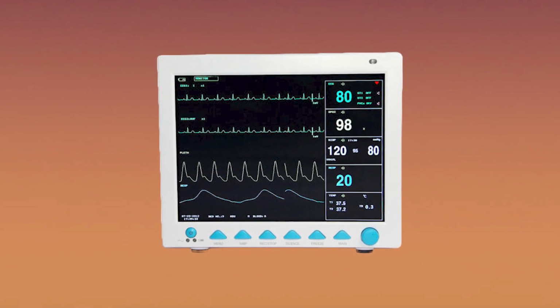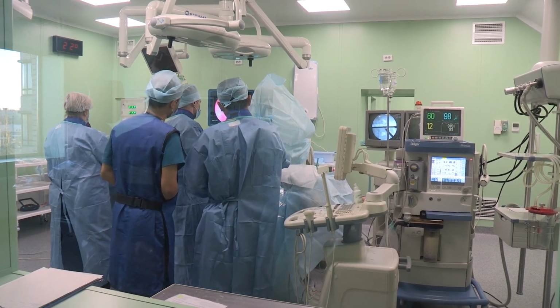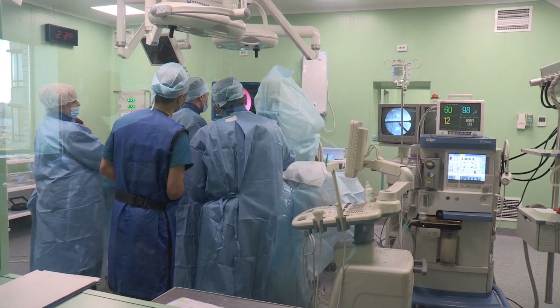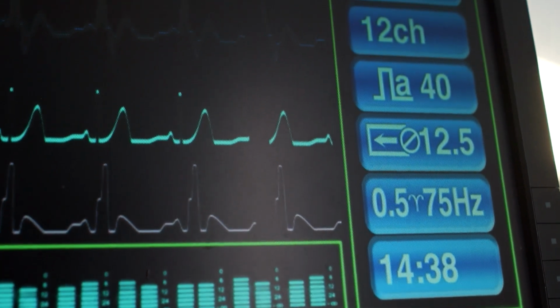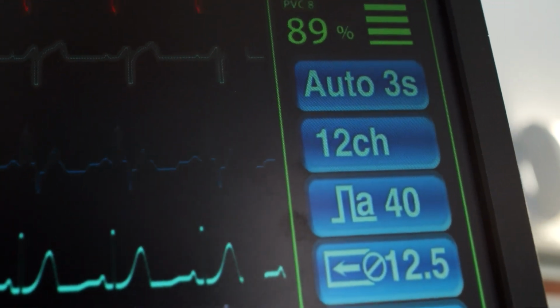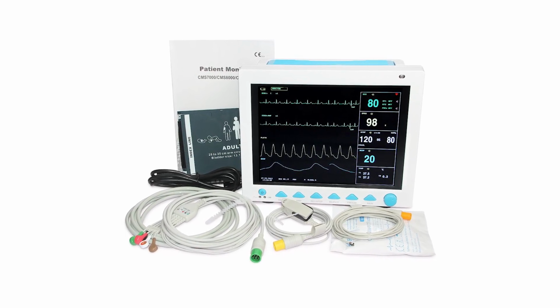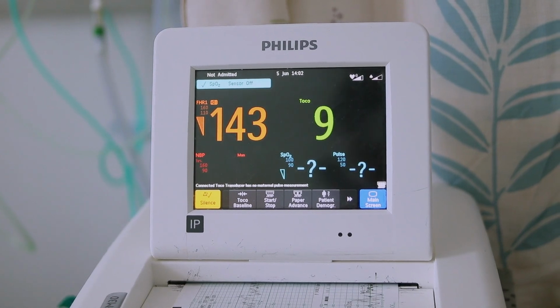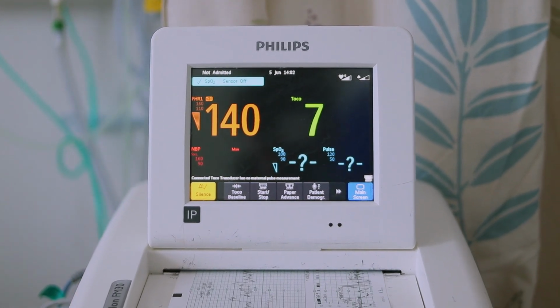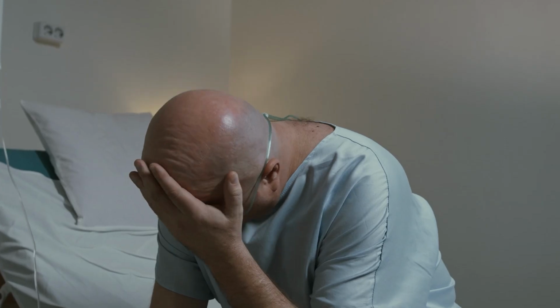Now the mitigation, as there's not really a patch available right now. The FDA recommends disabling all remote monitoring functions by unplugging the device's Ethernet cable and disabling Wi-Fi or cellular connections, then using the device only for local in-person monitoring. If remote monitoring is necessary, healthcare providers should use a different patient monitoring device from another manufacturer. Healthcare organizations are strongly urged to review CISA's fact sheet and implement the FDA's mitigations to protect patient safety and data privacy.